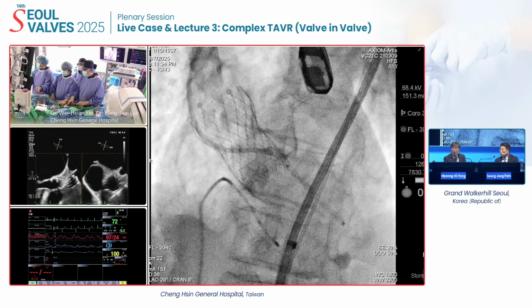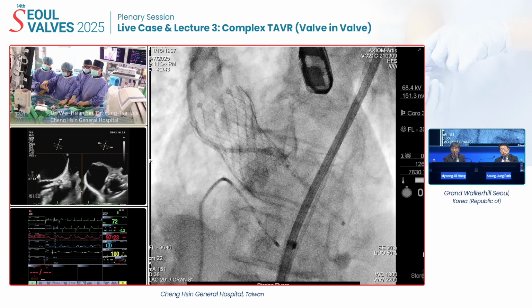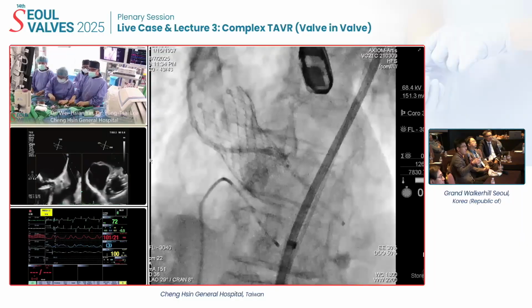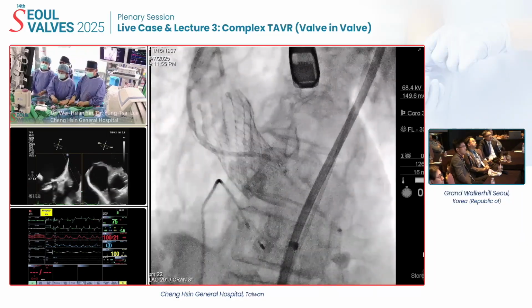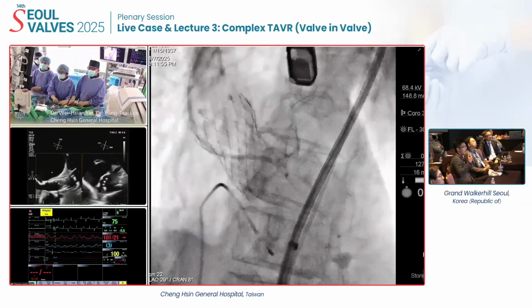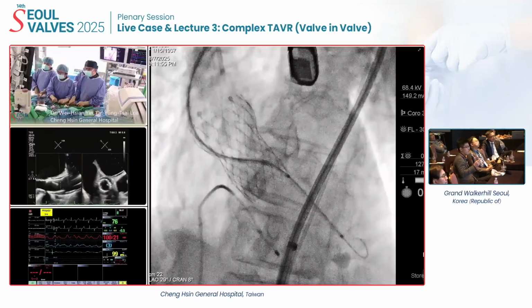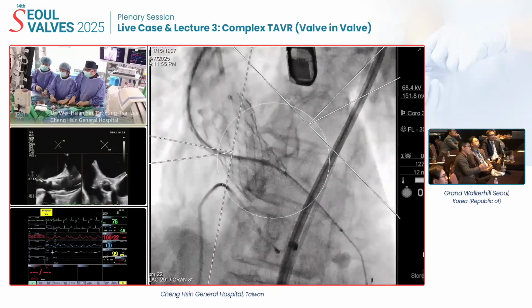What is the current stage in the fluoroscopic image? So what they've done just now, I think now they're passing a microcatheter into the LV, and they're probably going to exchange a stiffer wire, so that subsequently they can further perform dilatation of the fenestration using a larger peripheral balloon, and then later on they can deliver the SAPIEN valve across the fenestration and then deploy it within.